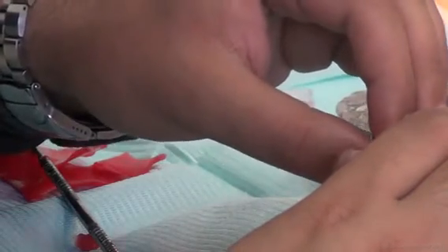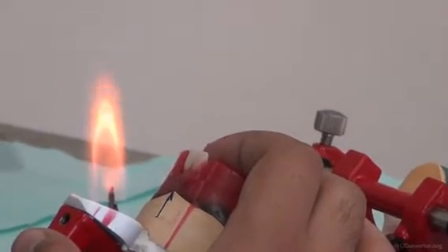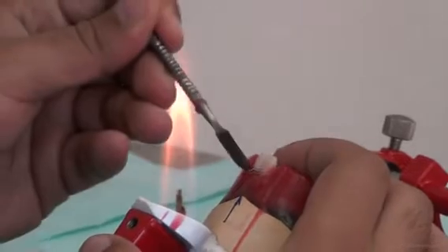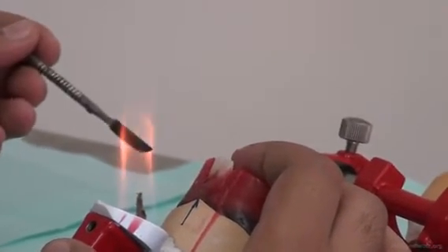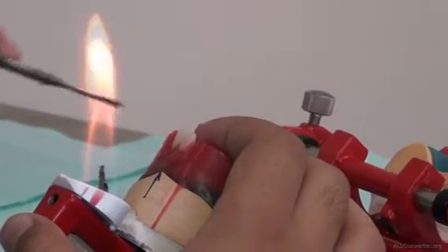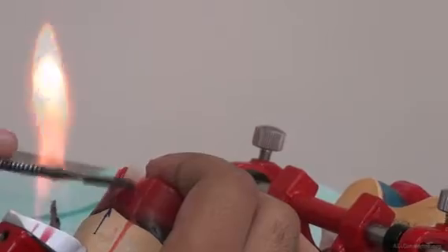So we put it according to the same rules of setting, which is 1 millimeter above the occlusal plane. The roots are depressed, and then once into location, we use molten wax and we begin filling in the spaces between the teeth, fixing it into location. And while it's still warm, we compare it with the upper. So if we need any adjustment, we can simply adjust it in the warm wax we have.